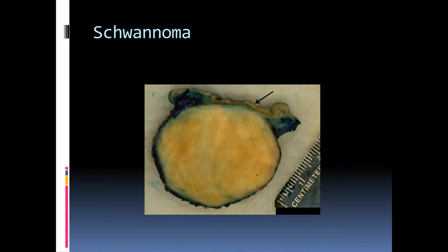Okay, so let's touch on schwannoma. So again, here we see grossly. You should be able to look at this grossly and evaluate where this lesion is occurring. Is this in the adventitia or is it in the muscularis propria? Is it in the submucosa? Well, it's not. Here's our mucosal surface. Here's the submucosa. So this is either adventitial or outer portion of the wall, because this is not sort of barbelling up into the mucosa. This is sort of exophytic onto the serosal side of things.